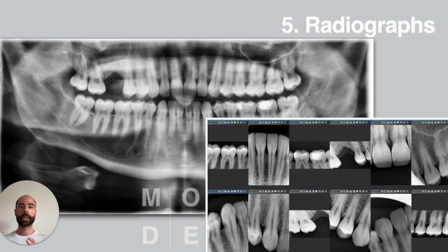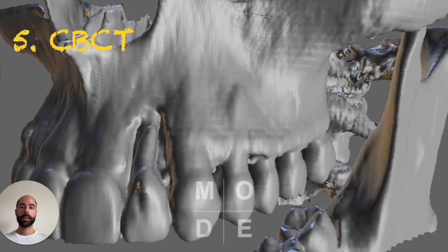After that, of course, you need your periapical radiographs and bite wings, even if you do the panoramic x-rays for every new patient, because you can't plan your restorative cases properly with just a panoramic. And for your surgeries, you must do a CBCT.